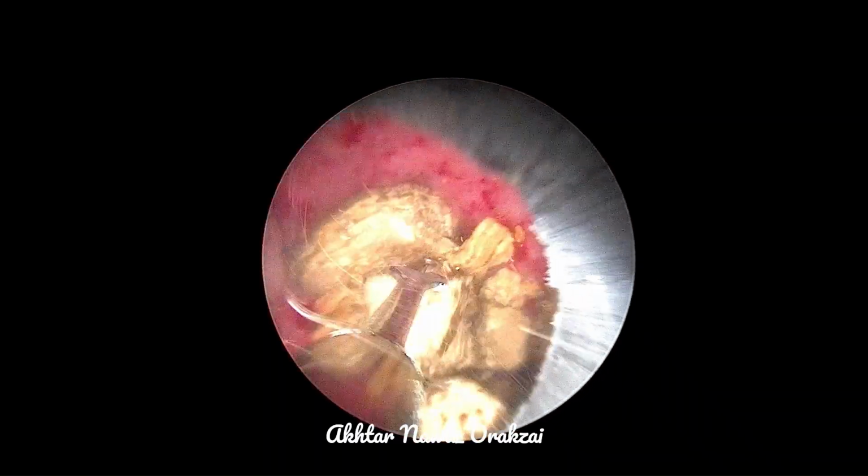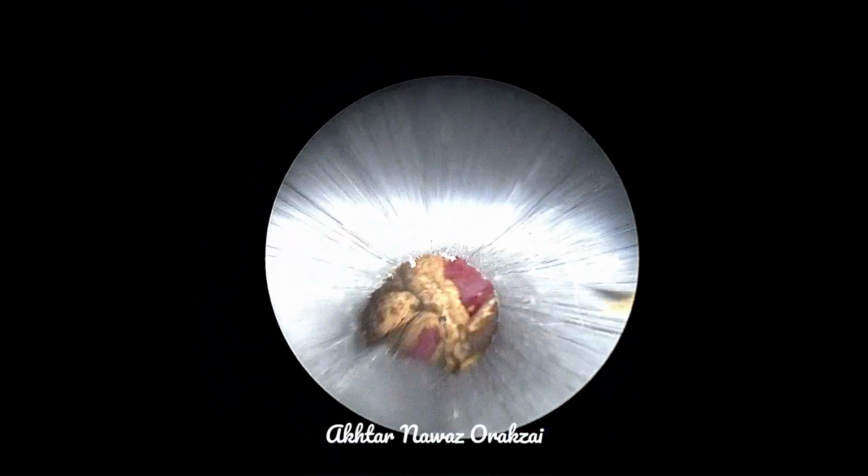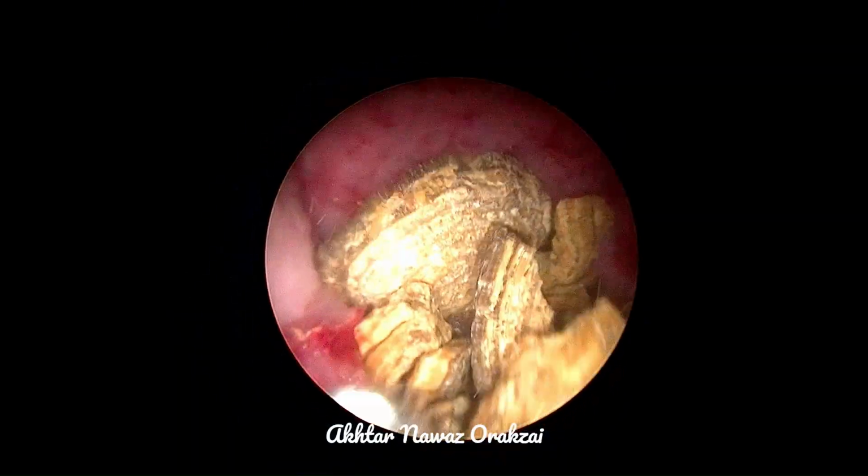So in that case, a vesical lithotomy would have been the preferred choice. But since his prostate can be dealt with transurethrally with resection, that's why we decided to perform the stone clearance through the percutaneous route.